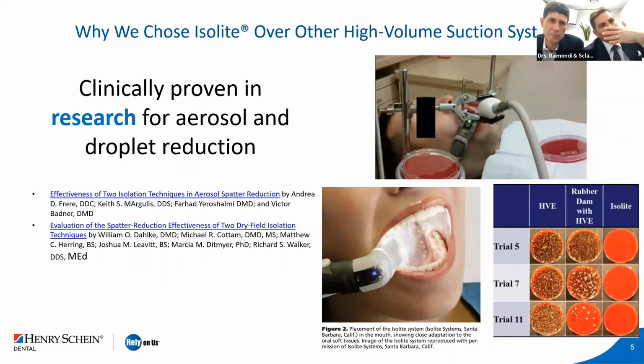Those units are then getting pulled apart, and the air is being filtered back into your room, right? I'm sure there's a filter on the unit, but I'm just wondering, practically, how are you really working with that device over a patient while you're prepping and visualizing and doing everything else that prosthodontists or dentists do? The nice part about this is it's connected to the high evacuation suction in our office, which is away from everybody else. Even in New York City, it's in an area where nobody is. That room itself has several air filters in it to make sure everything's clean. And the air in the operatory is also being filtered with the external air filter that we have over your shoulder, over there. This is also the point of care. 90% of the aerosols and droplets aren't even entering the room.